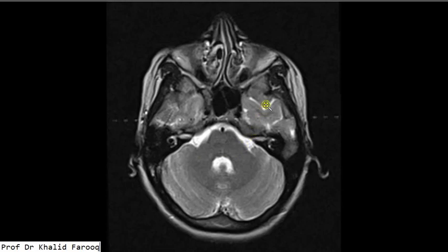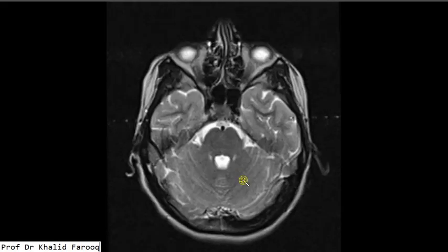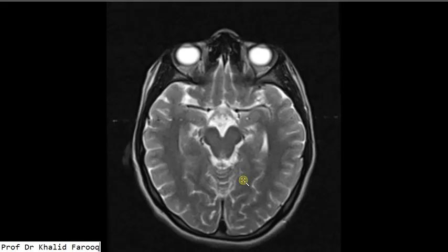Here we have the axial T2 sequence. We can see pons, basilar artery, pre-pontine cistern, seventh and eighth nerve complexes, fourth ventricle and cerebellum, and the middle cerebellar peduncles on either side.